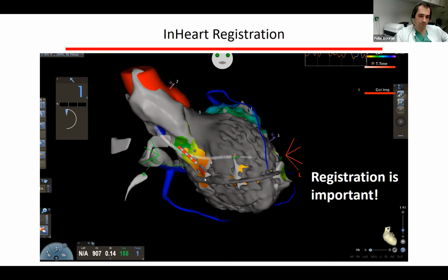Yeah. And ideally, when acquiring these fast anatomical maps, so Usha will tell us that it's not needed when you have ICE, but when you're stuck with FAM, the best is to use the ablation catheter and not a multipolar catheter to acquire these FAMs. It takes a bit longer, but it's much more accurate in terms of localization. And also to set the respiratory settings of the CARTO quite strictly to really acquire geometries that are not impacted by respiratory motion. This is an important step, of course.